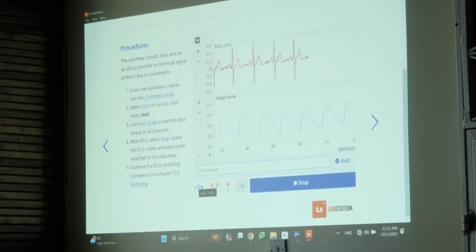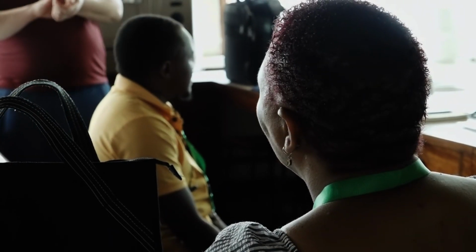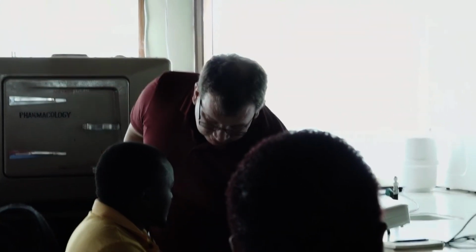One thing, if you don't get a really good signal, it's much better now. You can add gel, or first some abrasive gel to get rid of old skin tissue and increase the conductance, and then of course with gel it becomes even better. But that's why we use the sticky electrodes. They have some gel inside. So let's just see, but it looks good.